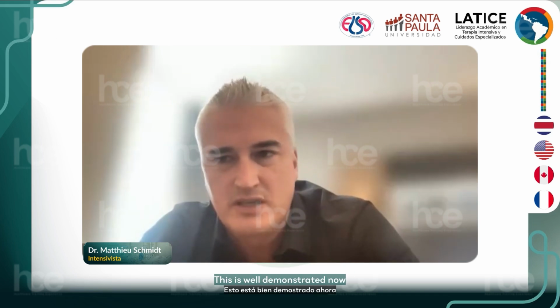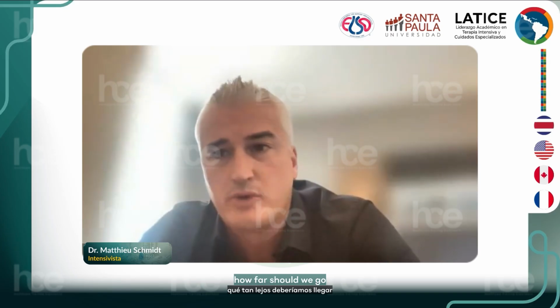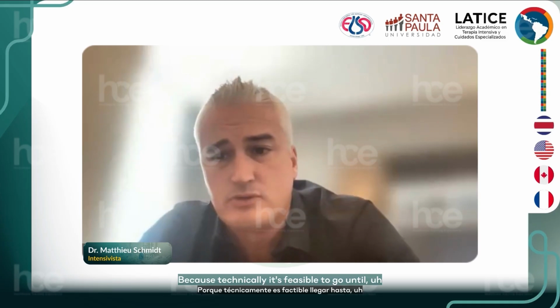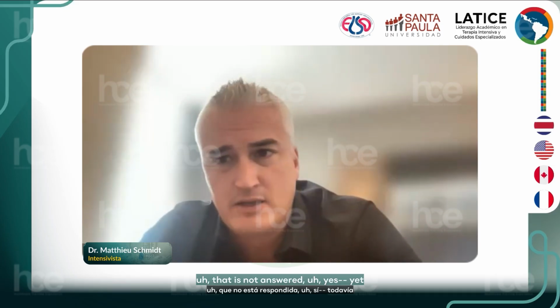This is well demonstrated now, but what we don't know yet is how far we should go. Technically it's feasible to go until reaching an apneic ventilation, for example. Is it useful for the patient? This is another question that is not answered yet.